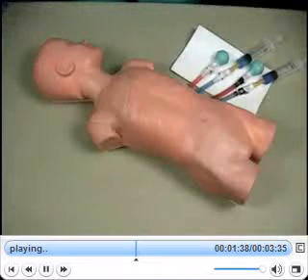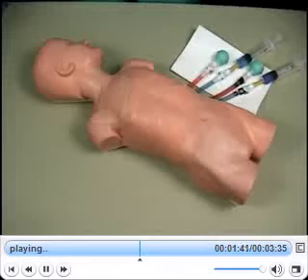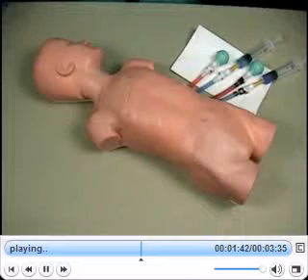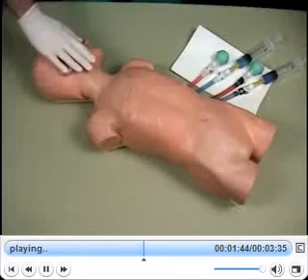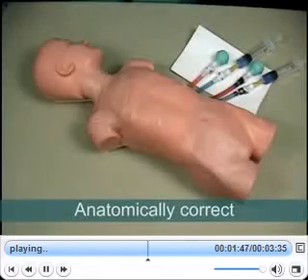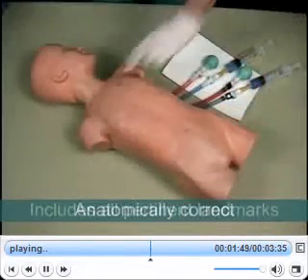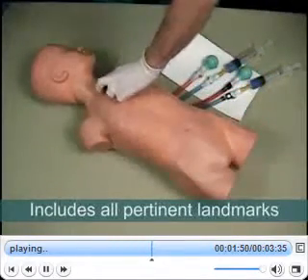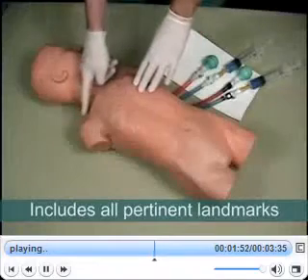Similar to an actual patient during this procedure, Vascular Access Child is oriented with the head turned to the left, and all of the important landmarks are present for each site. The subclavian site includes the sternal notch, the first rib, and the clavicle.